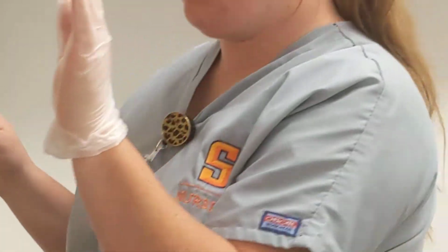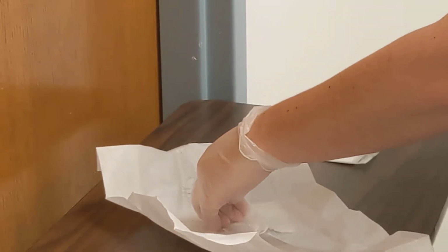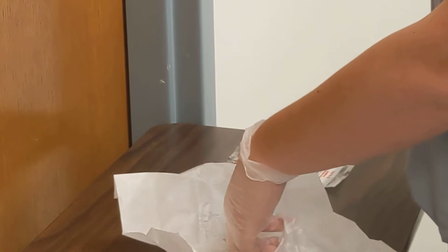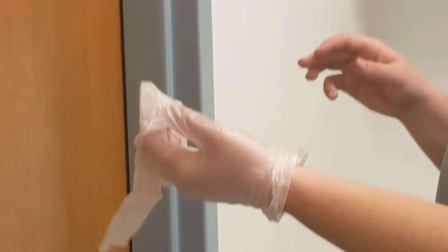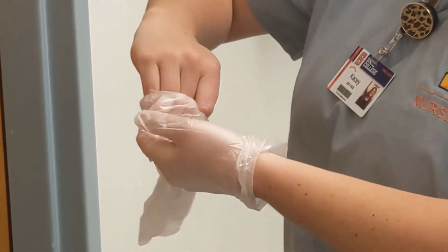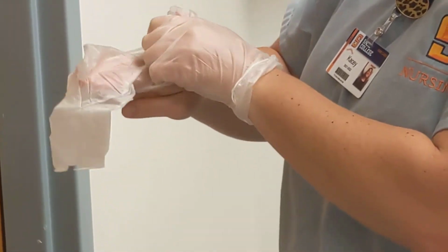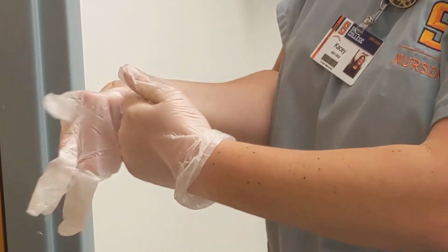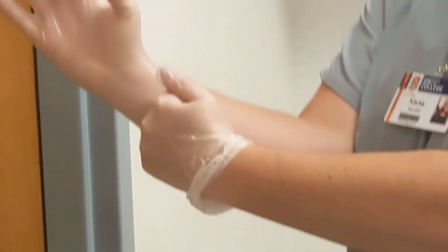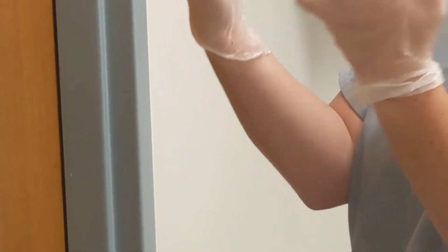Okay, so that's on now. So now we're going to just get the cuff of this. Okay, so we have our sterile gloves on now.